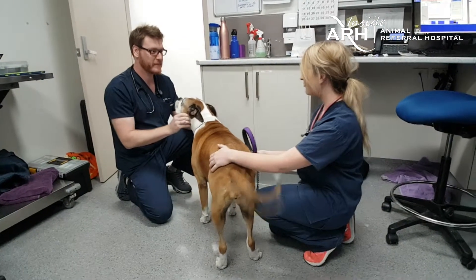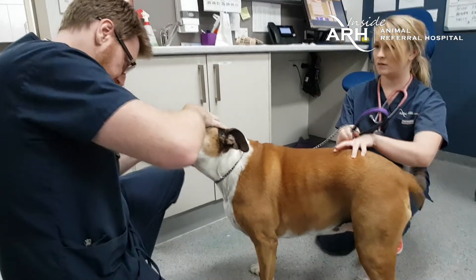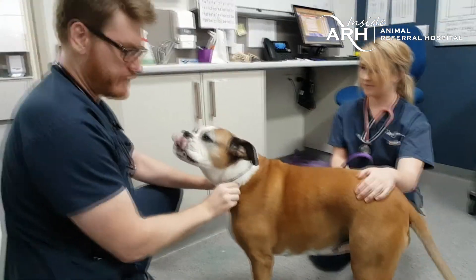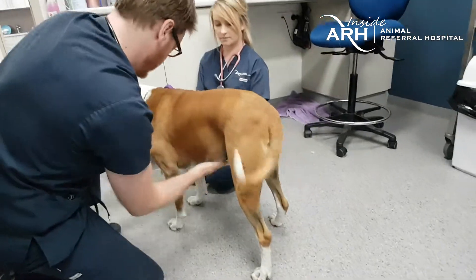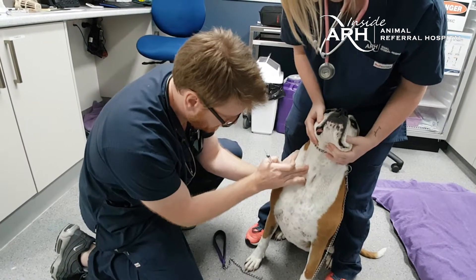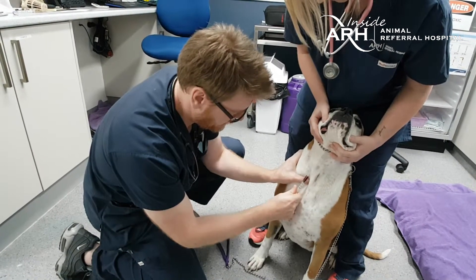The veterinarian checks in on how Diaz has been doing at home — no problems at all. The physical exam proceeds, with the doctor feeling the lymph nodes. Blood work will be run to see how everything looks, and then the dose will be worked out for the day. Jugular venipuncture is used to collect blood from chemotherapy patients in order to preserve the peripheral veins for catheters for delivery of the actual chemotherapy.